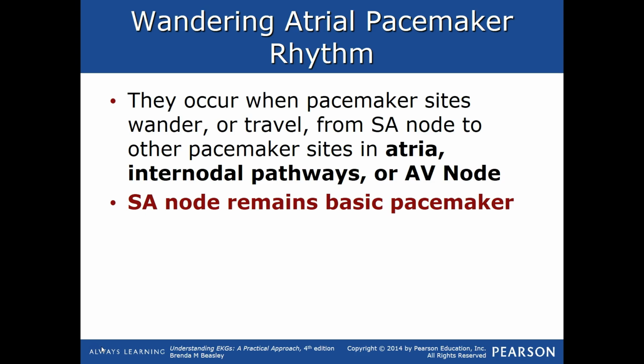So our first rhythm, wandering atrial pacemaker. A lot of times, just by looking at the titles of our rhythm, we can figure out quite a bit. Right away it tells us that it's atrial as well as wandering, and that's kind of an interesting word to think about with a rhythm, but you're about to find out why it's called this.